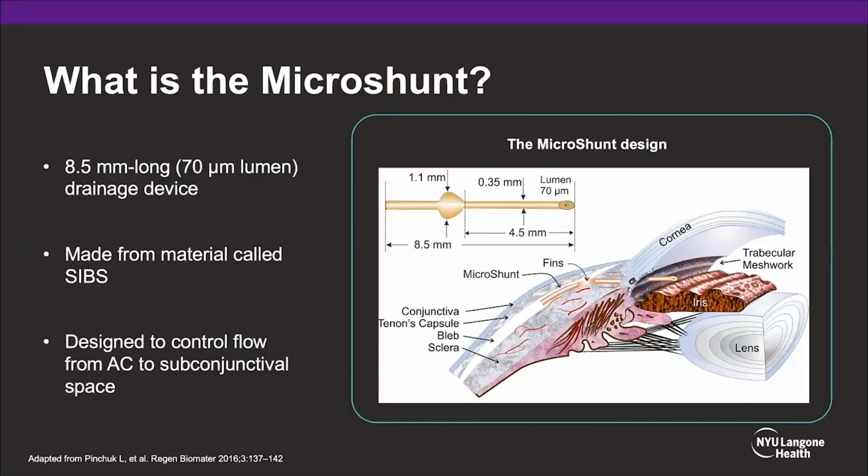So what is the Microshunt? Well, it's an exciting new device that is coming out here in the US. It is being used in Europe at the present time.